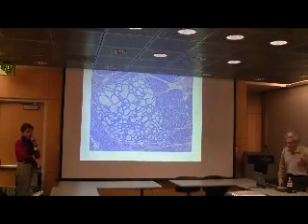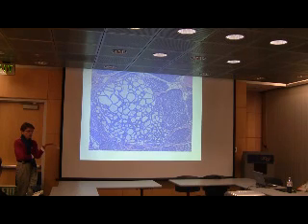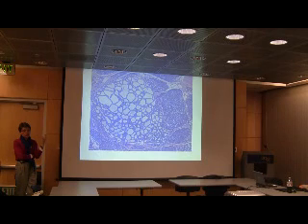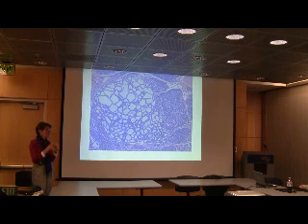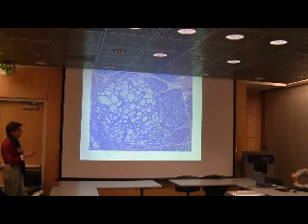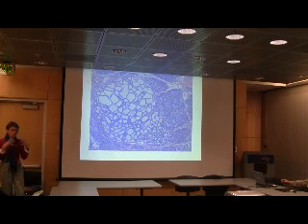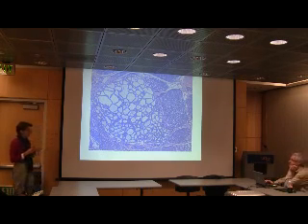So here this looks entirely different, but this is also a normal breast. For those of you who have been pregnant, this is what happens during late pregnancy, when you're just getting ready to lactate. There is enormous proliferation, growth of the epithelial component of the breast. And instead of being this small, most lobules become much more prominent, and they're now back to back, and there's very little stroma in between. The breast is enlarged in this process, and it's a reflection of all this activity going on.